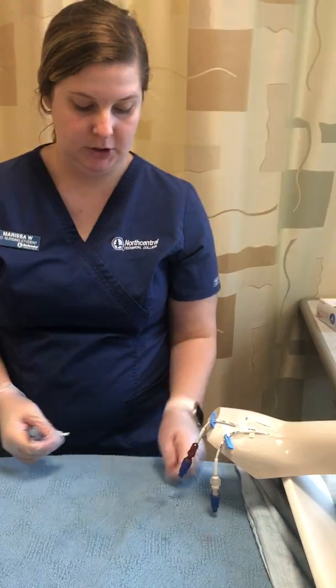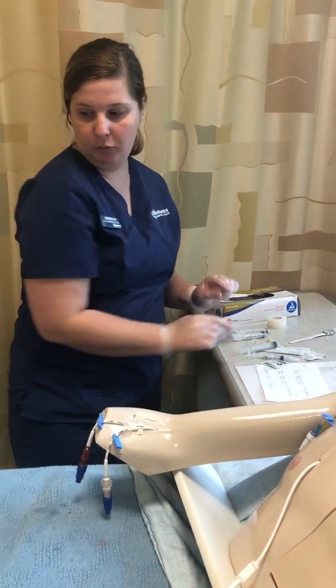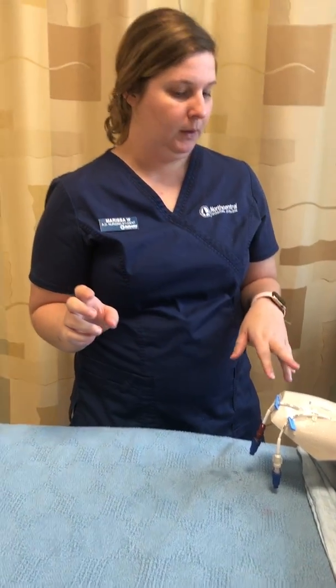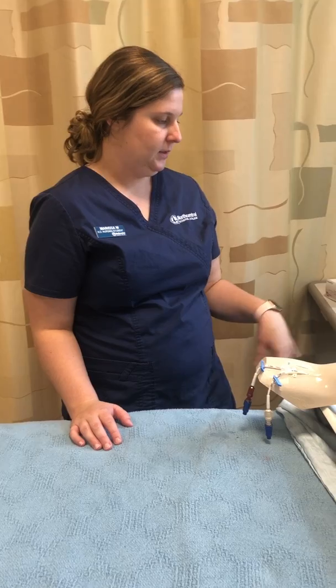And then when I'm all finished here, I would just dispose of my supplies. I would ensure patient safety by putting the bed down. Oh, I would take off my gloves before that too. When I was done, I would take off my dirty gloves and then I would ensure patient safety, putting the bed down, the side rails up, and the call light in place, and get rid of my supplies.